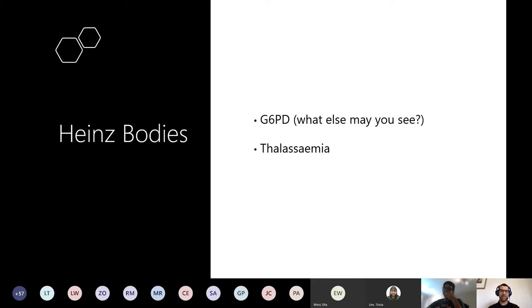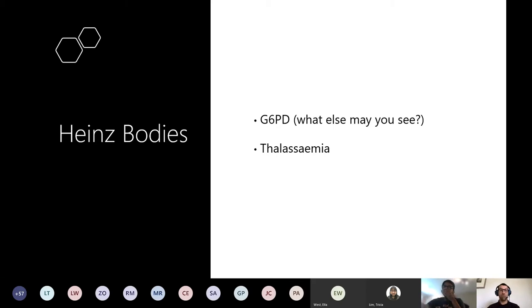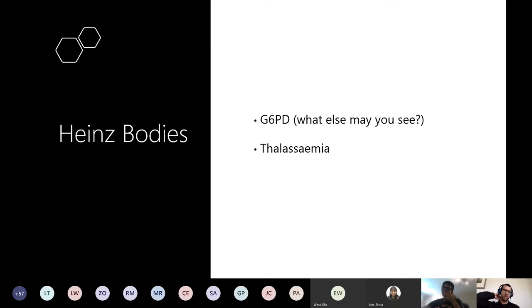These were Heinz bodies - they look very similar to Howell-Jolly bodies, and I don't think a question will ever ask you to identify them purely from the picture; there will always be a background stem explaining the presentation. Heinz bodies tend to be pathognomonic for G6PD deficiency, which was the correct answer. They also appear in thalassemia. What else might you see in G6PD on a blood film? Bite cells - and Heinz bodies - exactly.